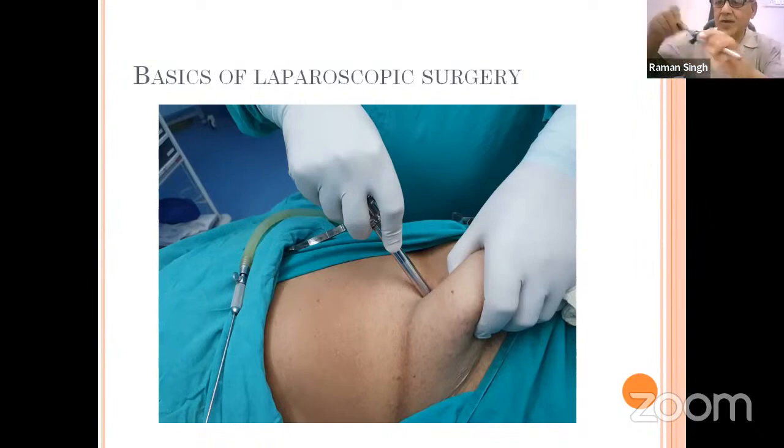Then you take out this trocar and connect this luer lock opening with the tube of the carbon dioxide, which is connected to the insufflator and the gas. After creating this first port, which is the navel camera port, the second working port is at the epigastric region.